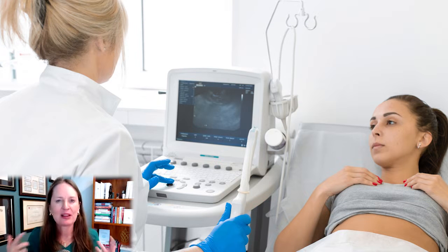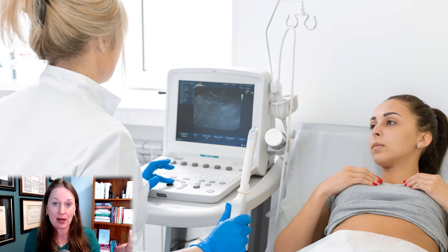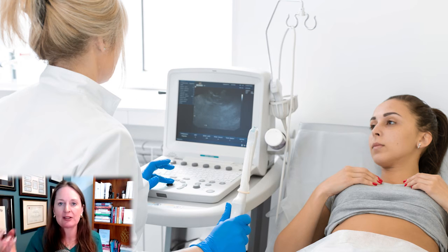And so that's how we are getting the images. So the second test, the saline infusion sonogram, pros are it has less specialized equipment compared to the HSG, which requires a C-arm and fluoroscopy, or a hysteroscopy that requires the camera and the ability to visualize what's going on inside the uterus. A saline sonogram just requires a transvaginal ultrasound, a speculum, and a little tube that allows the saline to get into the uterine cavity.